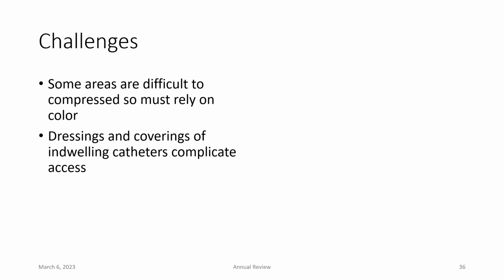Now, the upper extremity does come with some challenges. One of those was something we already mentioned, where our venous anatomy can be variable between patients, and so that can be a little bit challenging.